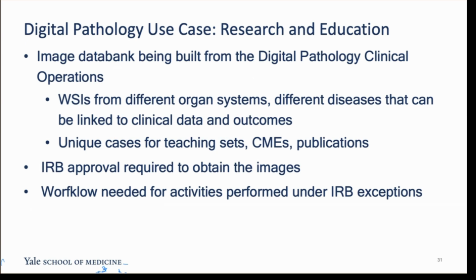As of now, if anyone wants to use these images, they have to get an IRB approval before it's given to them because there's patient metadata attached to those images. But we recognize that there are some activities, for example, teaching sets, CMEs, that do not require patient metadata. And we needed to provide a workflow where we could give de-identified images for projects that could be done under IRB exemptions. And we just had to make sure that all patient identifiers are stripped from these images.